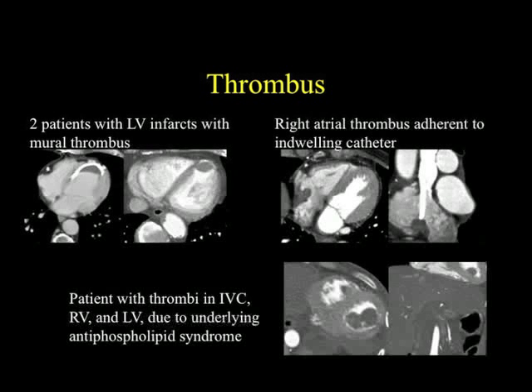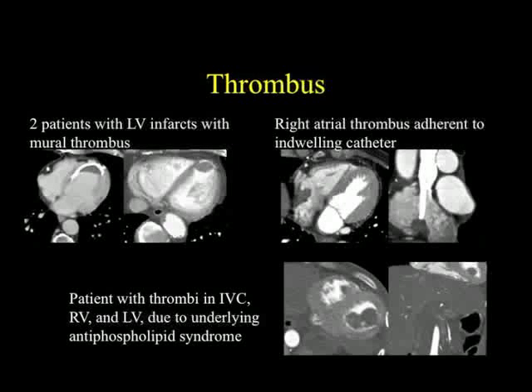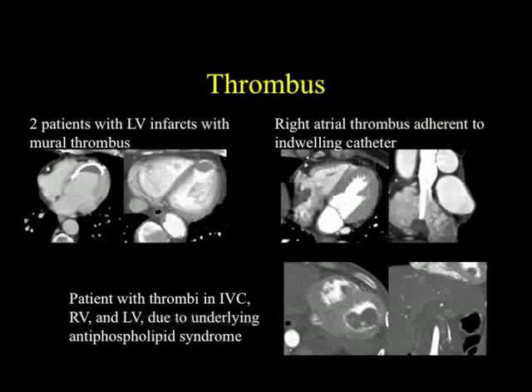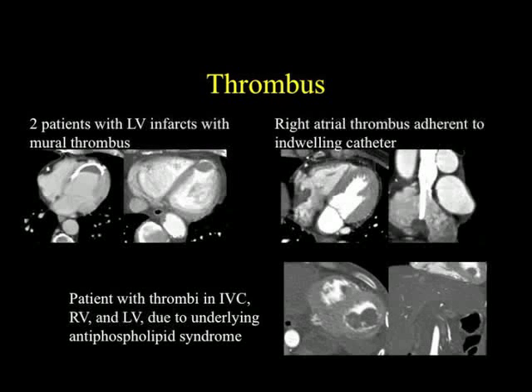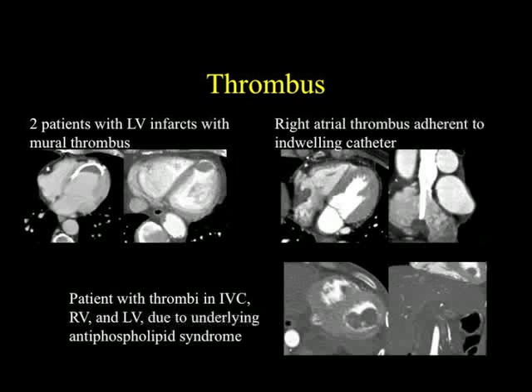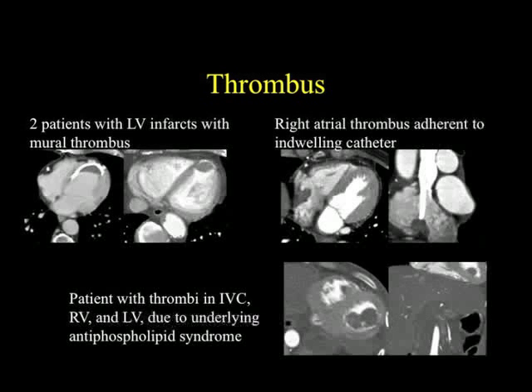Here's a nice example where you see the catheter extending into the right atrium and the thrombus adherent to the catheter — very nicely visible on axial images, and even more obvious on coronal or sagittal images. Here's a patient with thrombus in the IVC, right ventricle, and left ventricle due to antiphospholipid syndrome. Sometimes we see multiple areas of thrombus and infarction; if you see something in one of the chambers and then find infarcts in the spleen or kidneys, that makes the diagnosis even more certain.